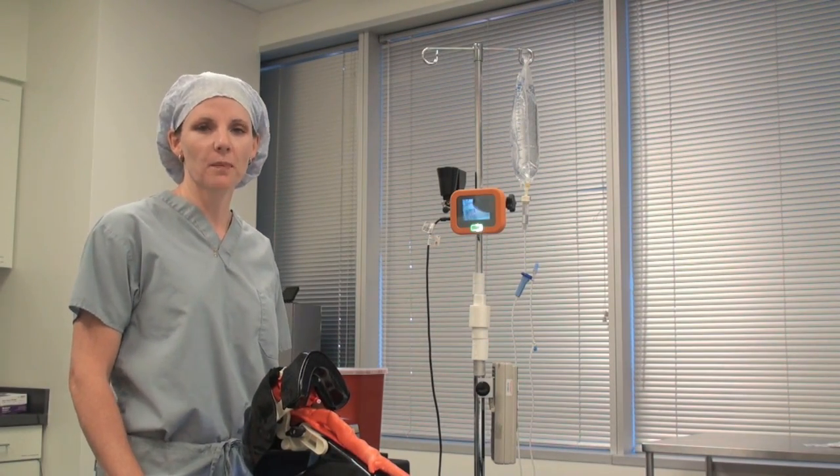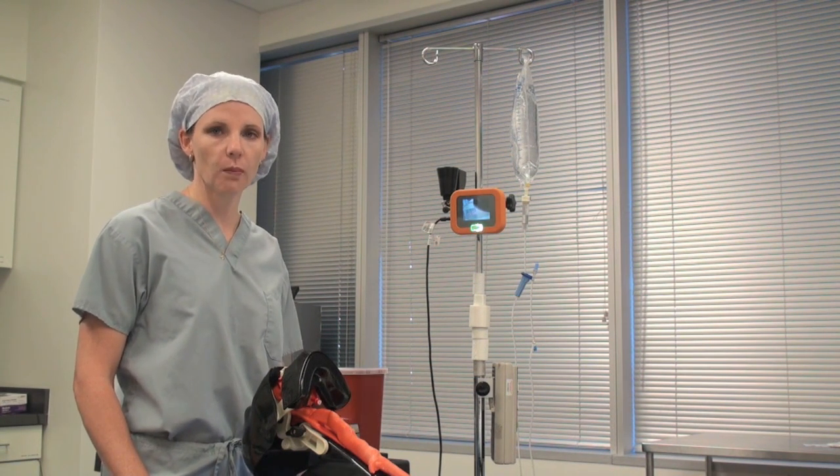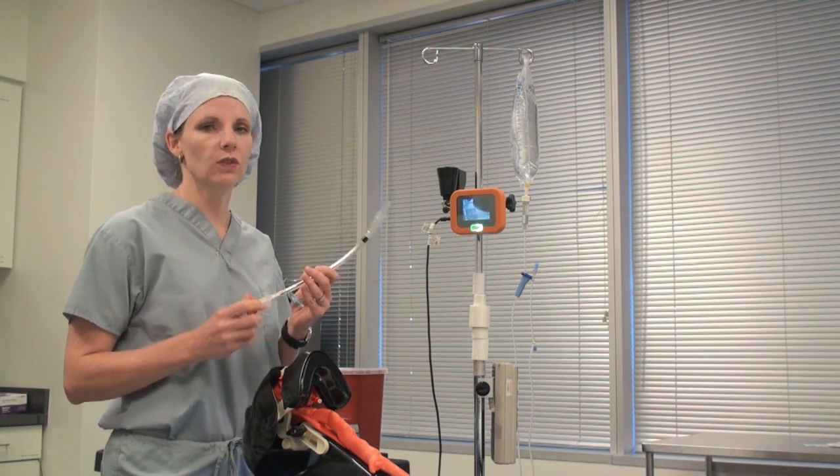Hi, my name is Amy Shepard with McGaw Medical and today I'm going to show you how to do an intubation with the Co-Pilot BL using a rigid stylet.